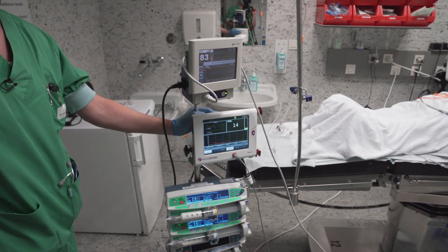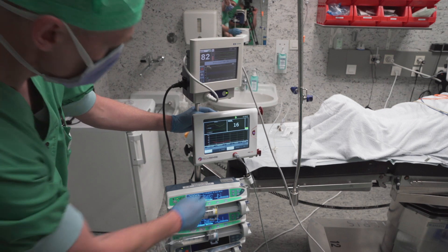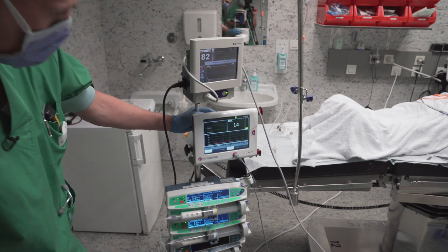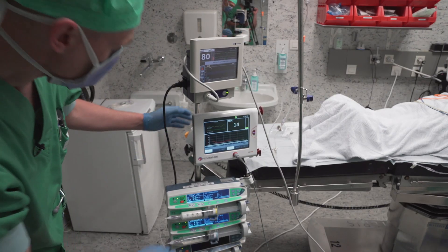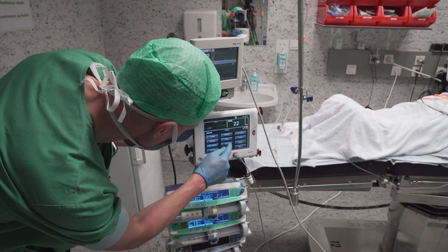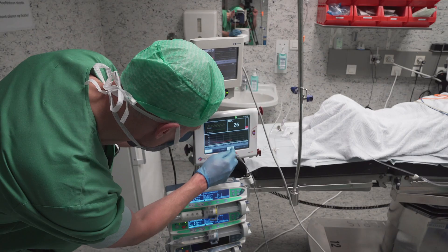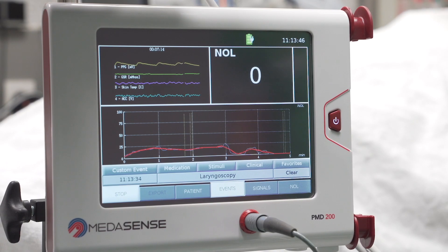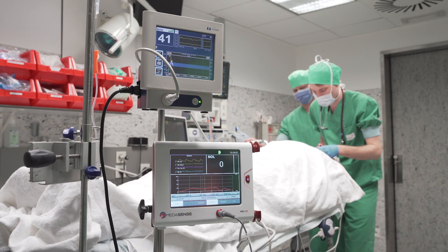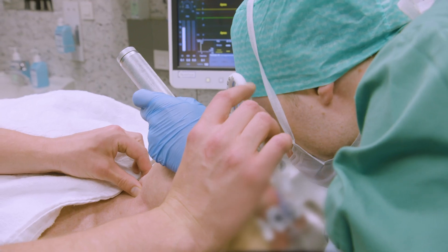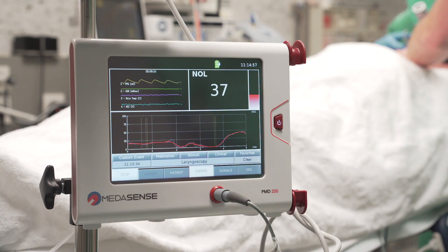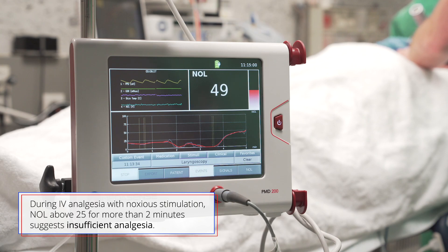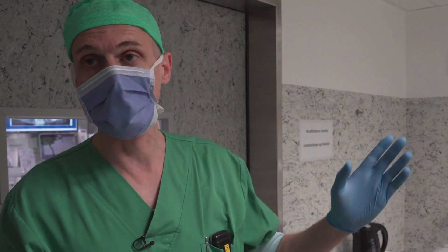I'm going to add it into the NOL as an event. It's a medication and we start some rocuronium. I will also add as an event a stimulus — we now have some chin lifts and positive mask ventilation that has started. It's a nasal intubation we need to do here, so my colleague will do a laryngoscopy. I will go to a remifentanil concentration of five because there's quite a high response on the NOL, and there's no response on the heart rate and the blood pressure. It's important to note that the heart rate and blood pressure did not change — so it's just the NOL that indicates there is insufficient analgesia in this case.